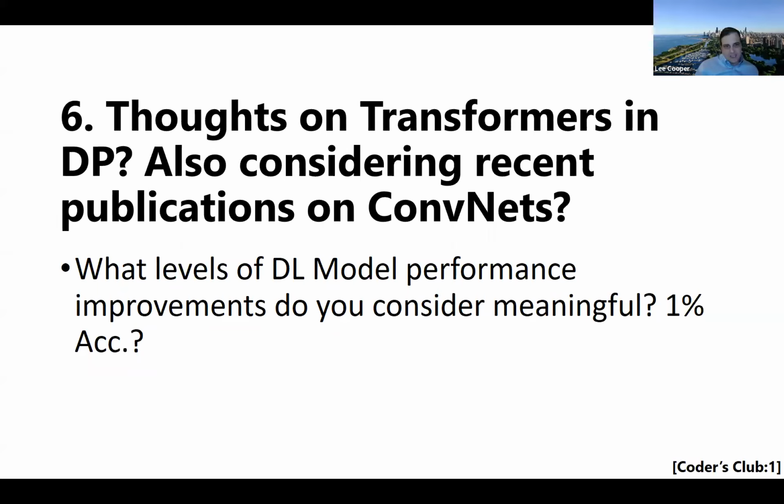I think it's like a traditional statistical power thing. So, 1%, I would say, well, what does this data set look like, right? If you have a massive data set that covers all these different histologic variants and things, then 1% could be really meaningful. But if it's just a small, noisy data set, then it probably doesn't matter.